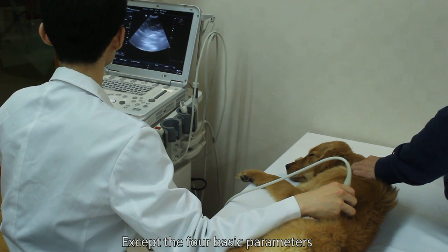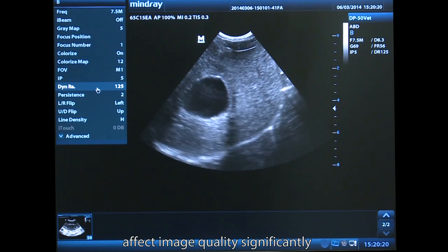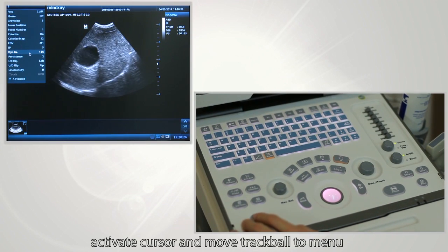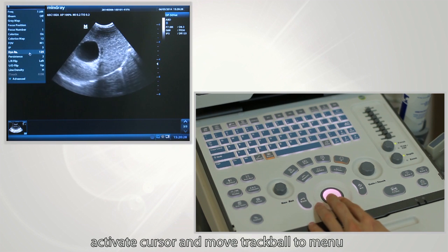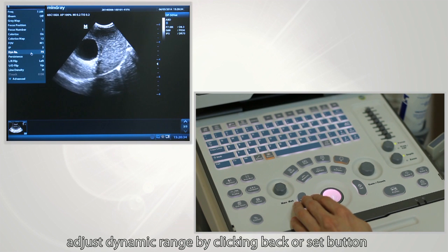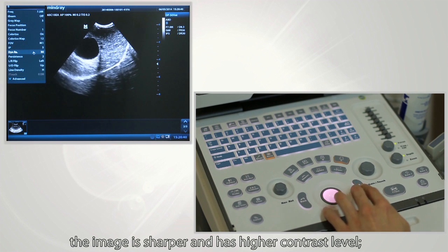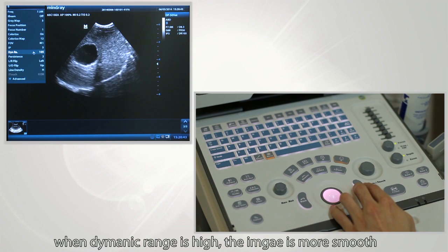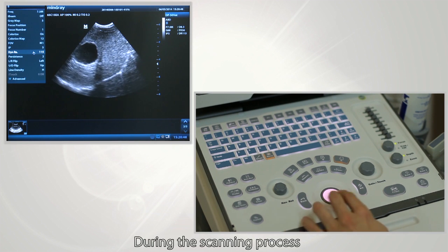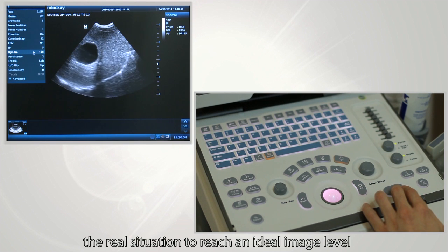Other than the four basic parameters, there are also other parameters that can affect image quality significantly. To adjust dynamic range, press the cursor button to activate the cursor and move the trackball to the menu. Select dynamic range and adjust it by clicking the back or set button. When dynamic range is low, the image is sharper with higher contrast. When dynamic range is high, the image is smoother but with compromised contrast. During scanning, adjust these parameters according to the real situation to reach an ideal image.